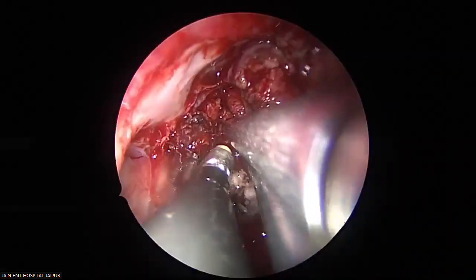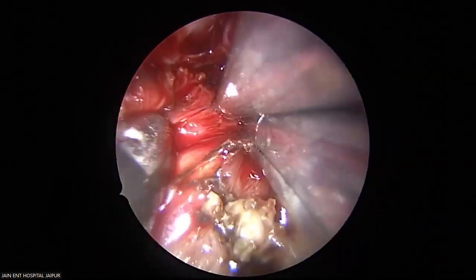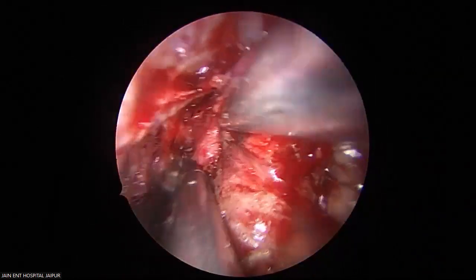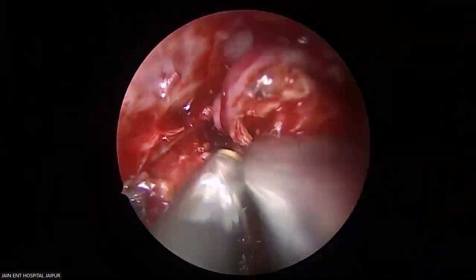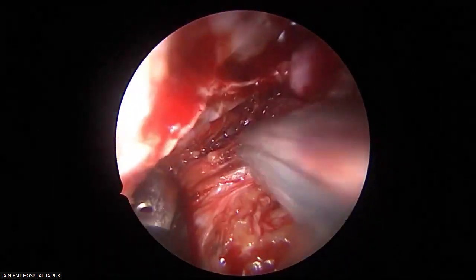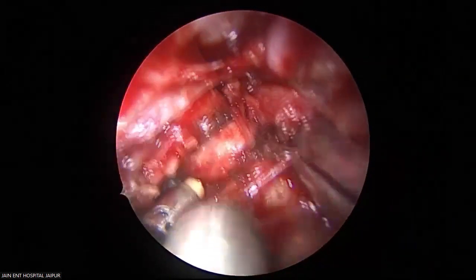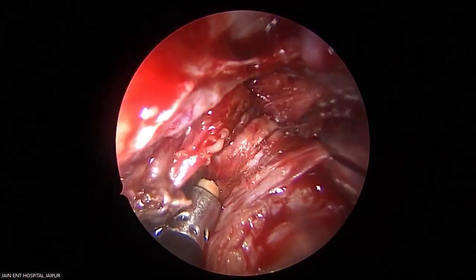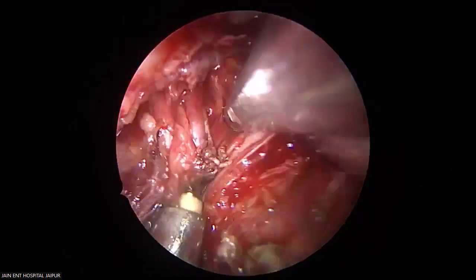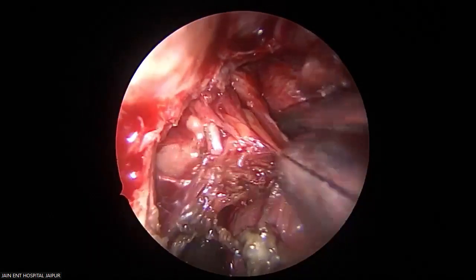See, I am right in the infratemporal fossa. Can we get a little more lateral exposure by cutting the bone?